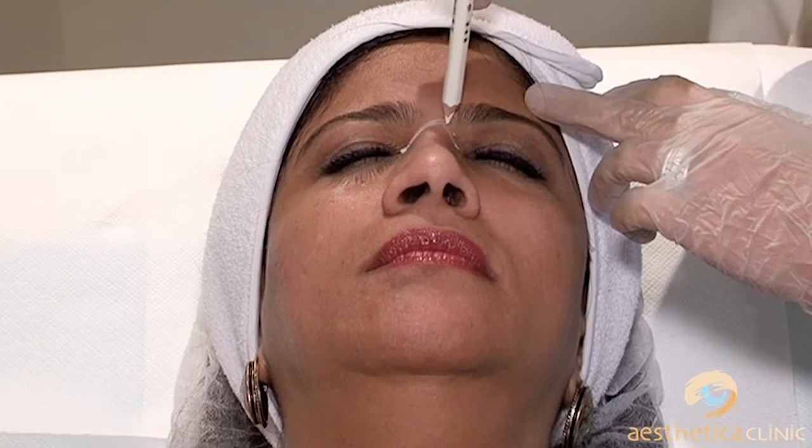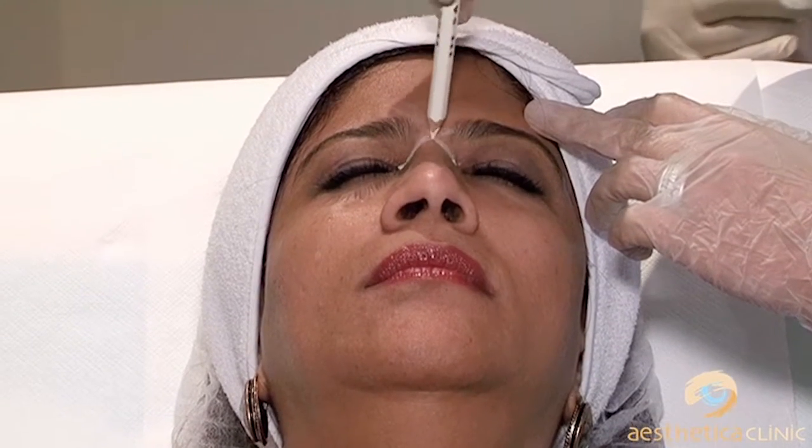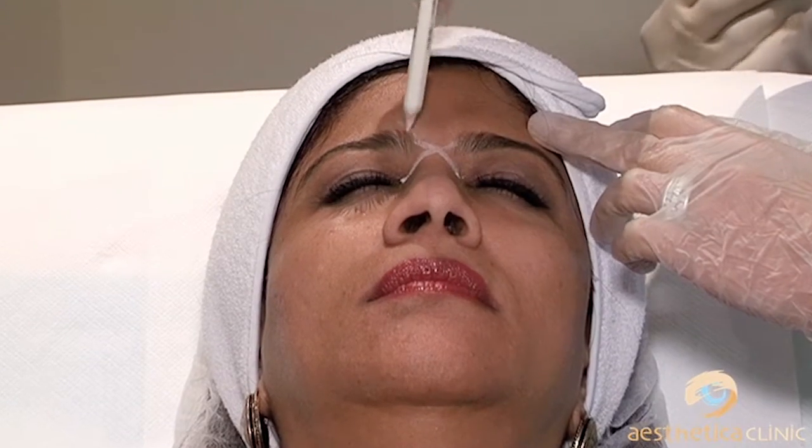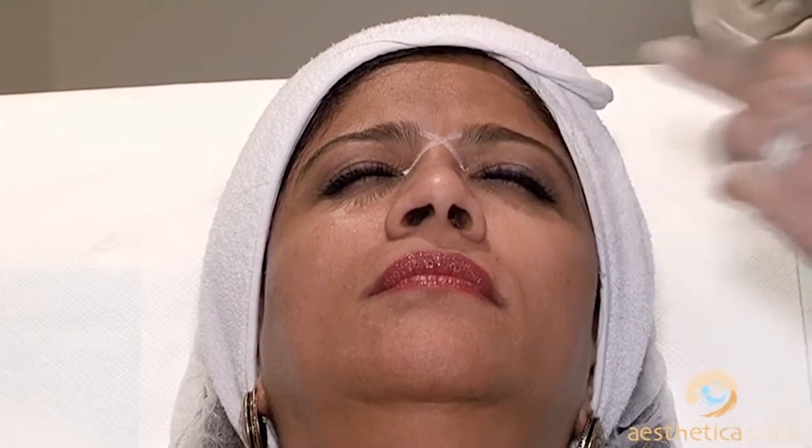She is drawing a line from the inner canthus to the head of the eyebrow, and where the line crosses, that will be the first point. I really believe people who are injecting at the beginning should do all these drawings each and every time for a long time. It's much better — it takes just one second to do it. So that's the first point for the procerus.